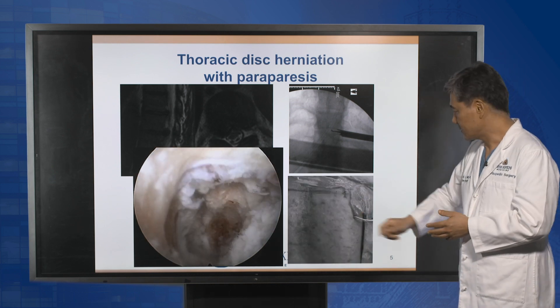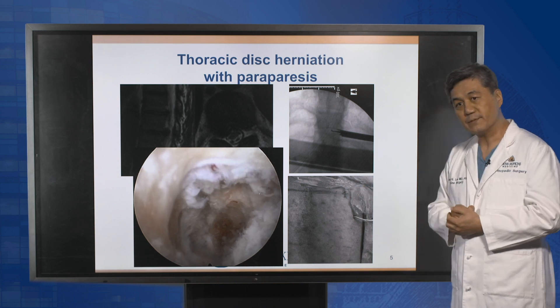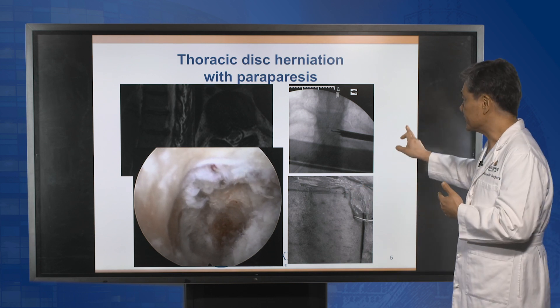This is the skin incision — a little bit off-center of the spine with a 7 mm working incision.